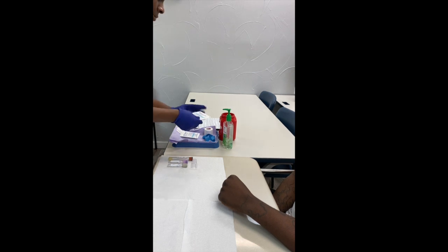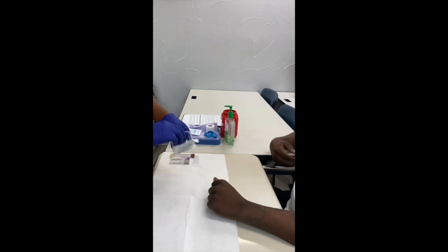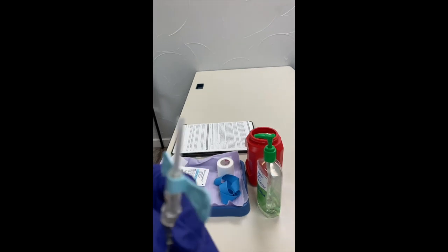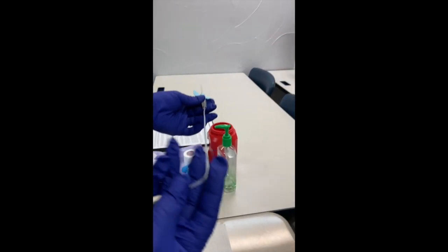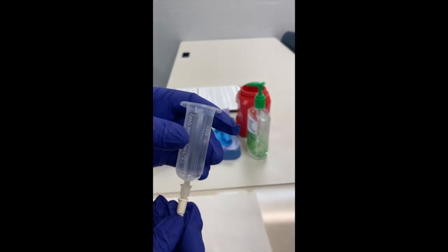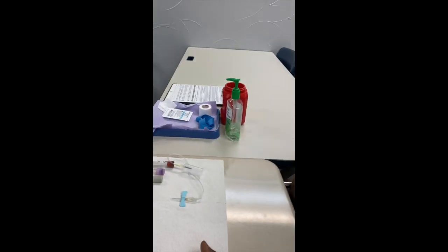We're going to use a butterfly, so we're going to go into your hand. With a butterfly, you want to go in at about a 10-degree angle — meaning it's pretty flat, but not completely flat. The butterfly has nice long tubing, and it also has a gripper. You can see the little bitty nodules, and you need to grab on to the gripper so you know you have it on the right side. Do not take off the needle shield until you're ready to stick. There's another needle at the end, so you want to turn that really tight — because sometimes you get them from the manufacturer and they're pretty loose.